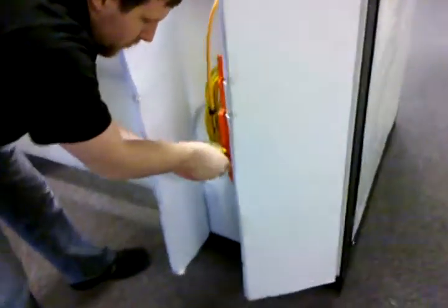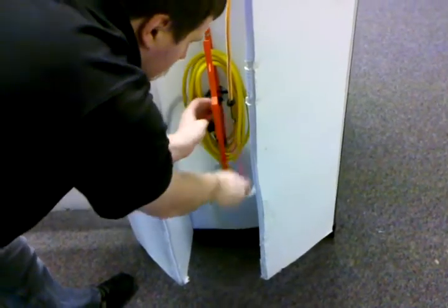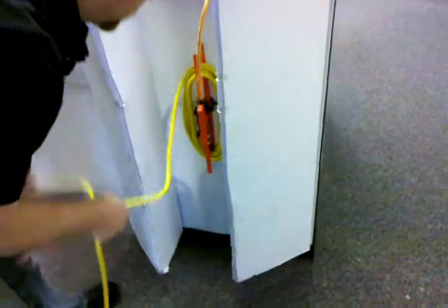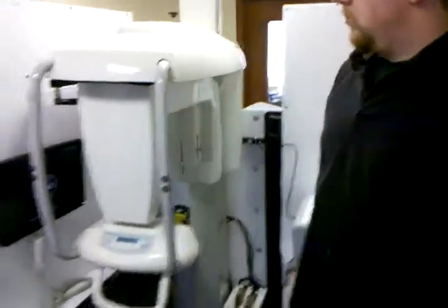Plug in the extension cord to the wall. Turn on the machine if it is not already on. Raise the head unit using the single controls, then open the left door.